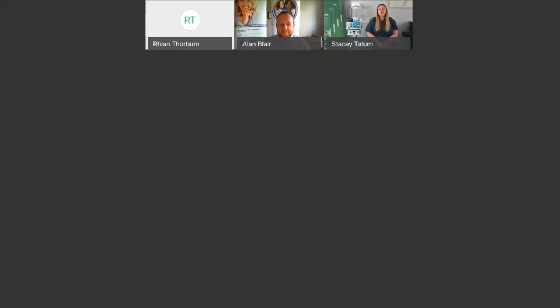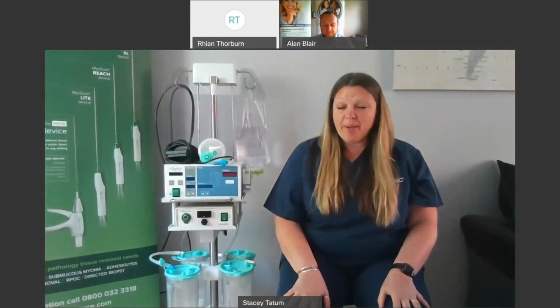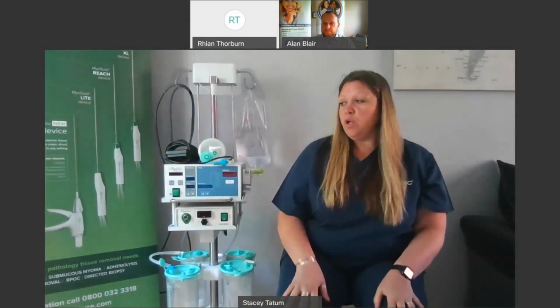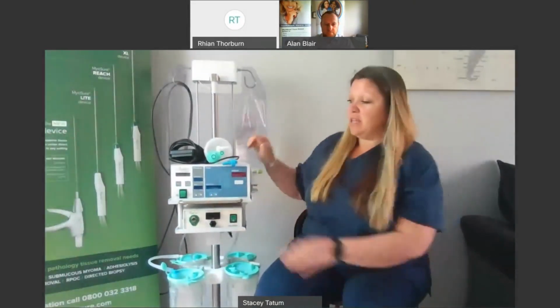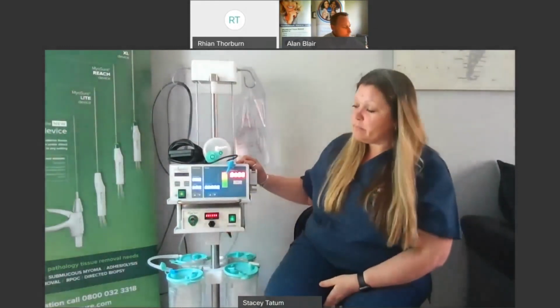Thanks, Alan. So I'm going to get straight on with the training because we've got a lot to get through and not much time. So when you are asked to do a MyoSure, you will need to get the MyoSure system out. Before you do anything else with it, before your patient's anaesthetised, it's probably best to just turn it on to make sure it's working.